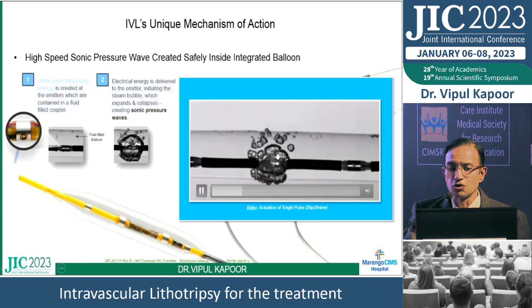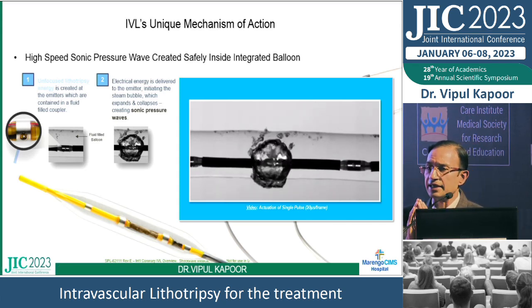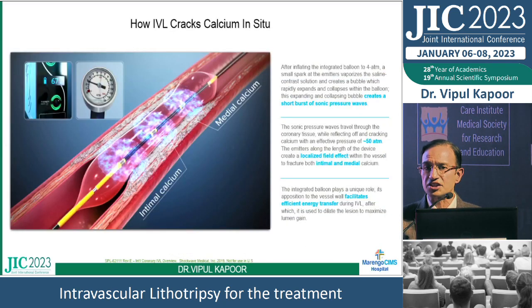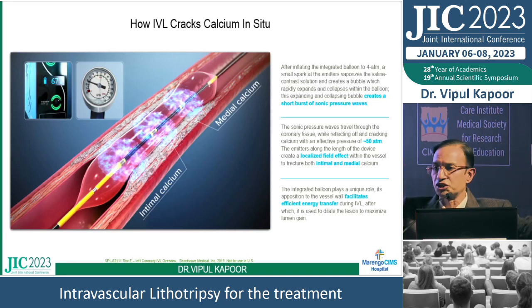So as you can see, it is almost like an explosion. So there is a sound wave, and in that there is a contrast and a saline solution, and it actually produces an explosion. But you would ask me, does it not cause injury? No, because the energy that is produced is very, very little, and this energy is destined to hit only the hard calcium. The soft tissue beyond the calcium is not hit, because it is just dispersible. When it goes to the calcium, it hits it and comes back. With the soft tissue, it will just dissipate through the soft tissue. So it doesn't injure the soft tissue at all. It just injures the calcium, and that is the beauty of this technology, right? So this is how it works.